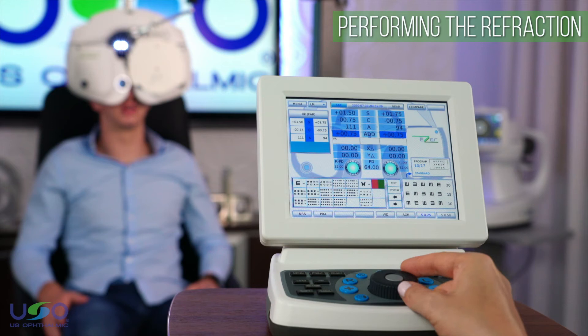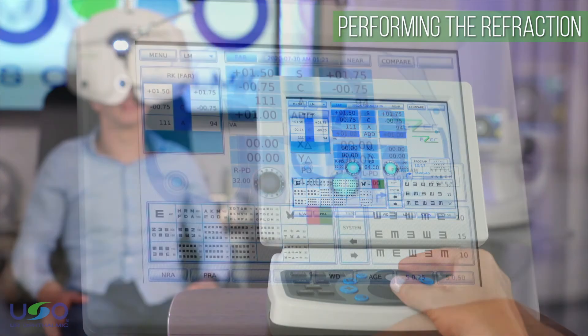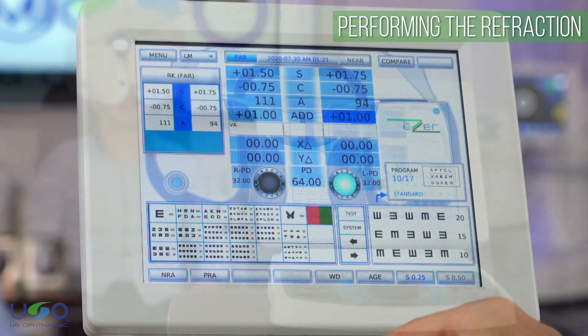Rotating the central knob allows you to add positive spherical values to the refraction already obtained. This can be done simultaneously for both eyes, or for each eye independently, until the desired addition is obtained.